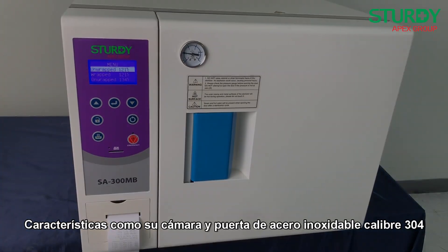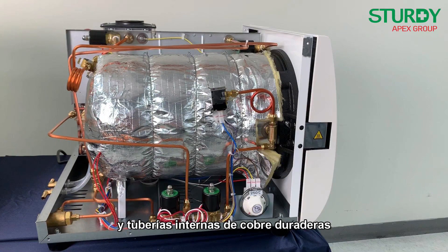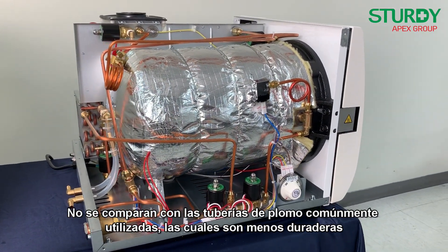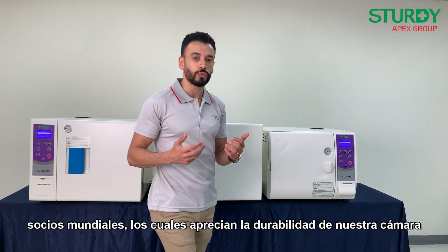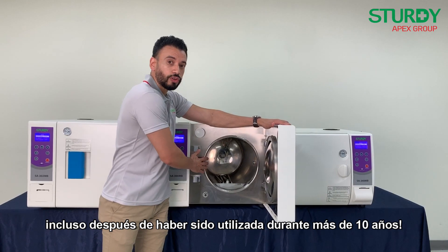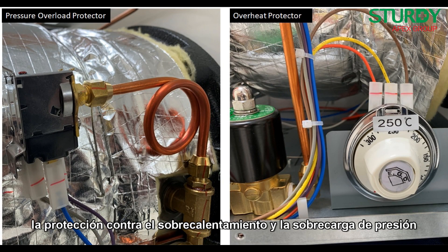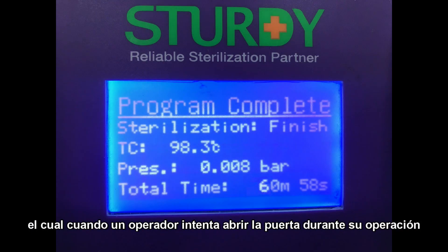The MB series is built to last. Features include a 304 stainless steel chamber and door, 316 stainless steel built-in heater, and durable copper inner piping versus the commonly used less durable lead piping. This sturdy build often receives acknowledgement and appraisals from our worldwide partners who appreciate the durability of our chamber even after more than 10 years of use.